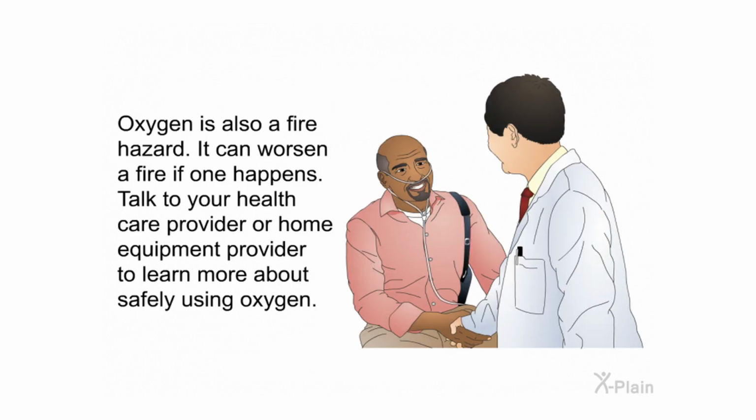Oxygen is also a fire hazard. It can worsen a fire if one happens. Talk to your healthcare provider or home equipment provider to learn more about safely using oxygen.